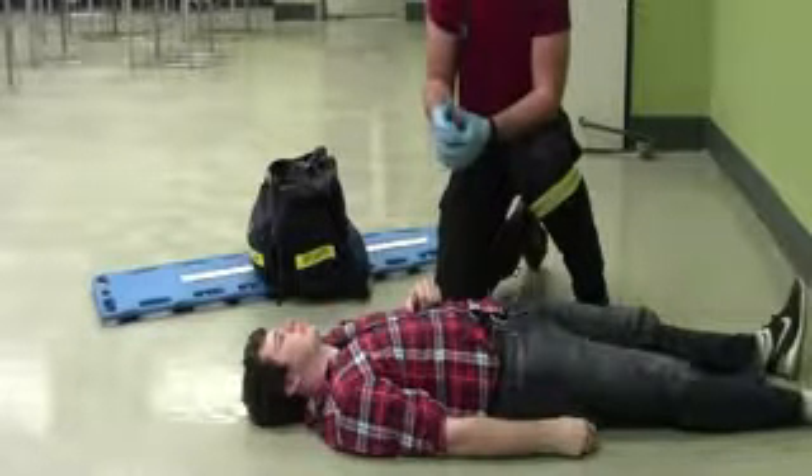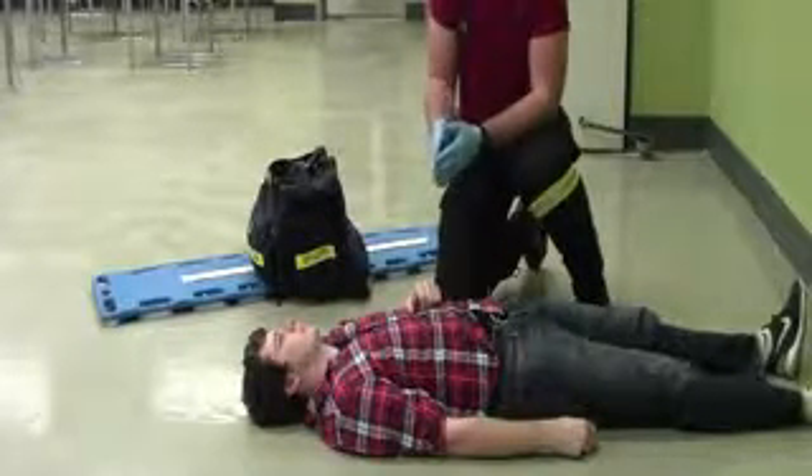Next, I'm going to ask my partner to hold manual in-line C-spine. Steve, are you able to hold C-spine for me?